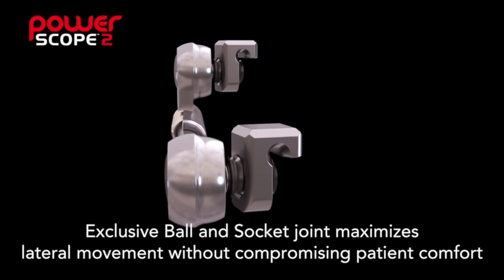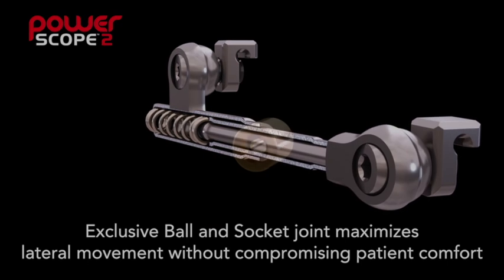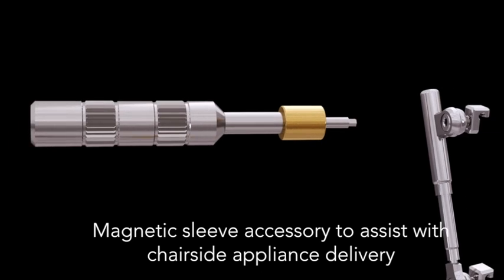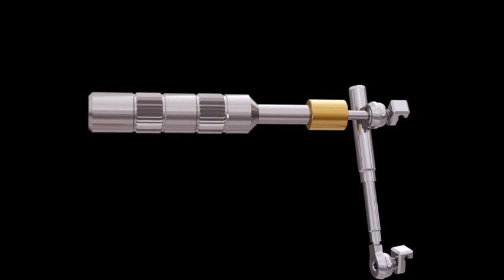The exclusive ball and socket joint helps maximize lateral movement without compromising patient comfort. PowerScope 2 now has a magnetic sleeve accessory to assist with chair-side delivery of the appliance, as well as securing the attachment on the wire during installation.